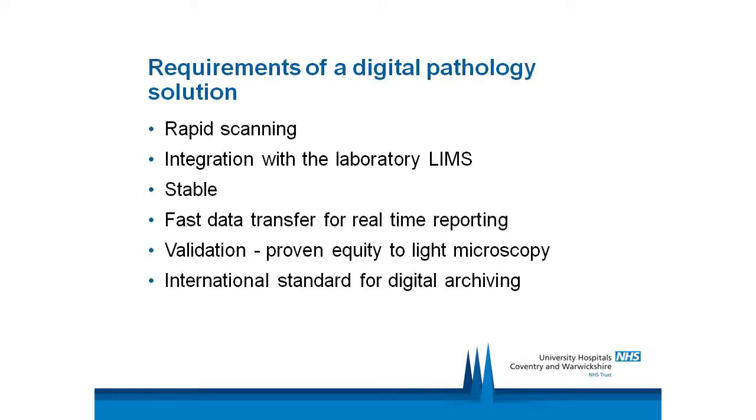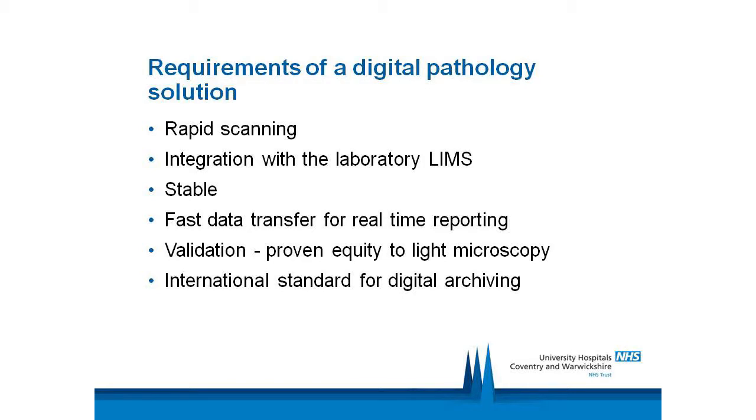Digitizing the workload of a surgical pathology lab presents a number of challenges. You really do need rapid scanning of the slides in order to get through the number of slides which are generated. Our laboratory generates 1,000 to 1,200 slides a day, so you need to get through them pretty quickly to do the whole lot. It needs to be integrated with the laboratory LIMS system for obvious reasons, and it has to be stable and provide reasonably fast data transfer to allow for real-time reporting.